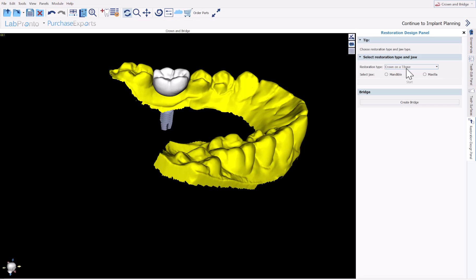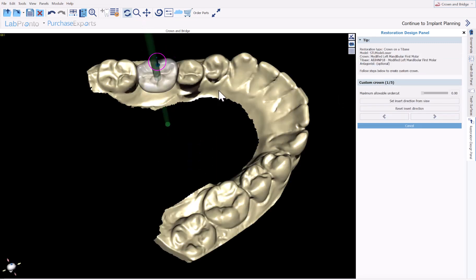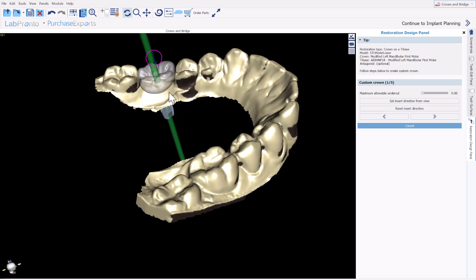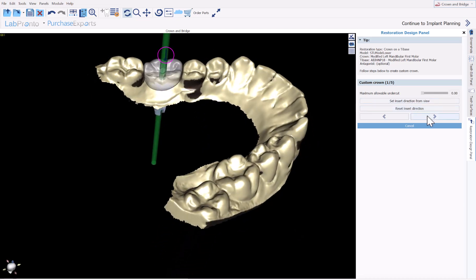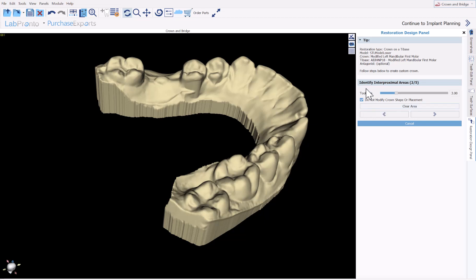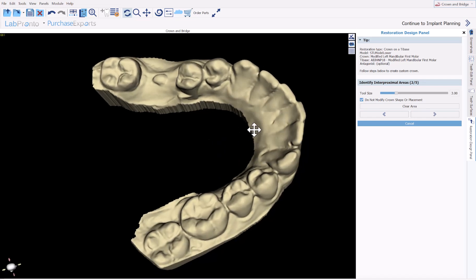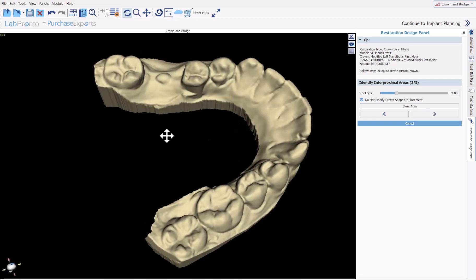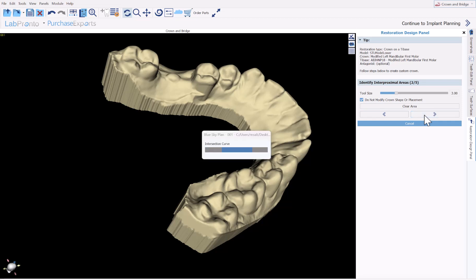Select Crown on a Tie Base, choose Mandible, confirm the model, confirm the crown, confirm the tie base — if you have one of each it's selected by default — and then click Start. The first step is the path of insertion, so go ahead and modify using the arrows or by aligning the model on screen and click Set Insert Direction from View. The next step is identifying the proximal areas, but since we already designed our tooth and are happy with the design, I'm going to keep the box checked for Do Not Modify Crown Shape or Placement and click Next.